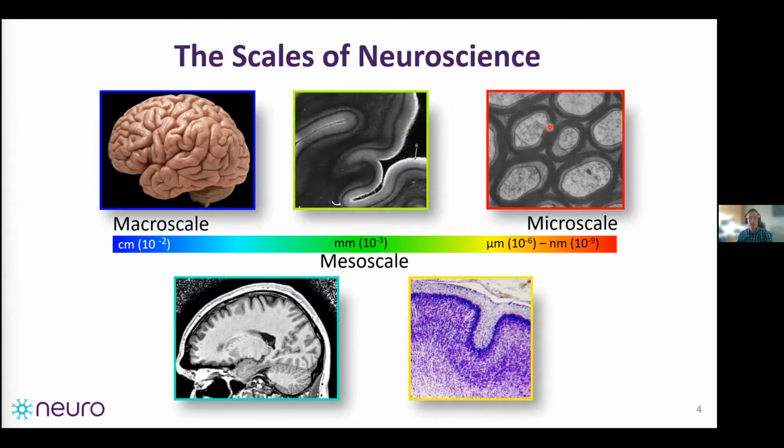So here, the best is really achieved with electron microscopy, but there's some super resolution light microscopy coming out that's giving another method to look at this, but that's sort of beyond this work. But really interesting with the microscale, we get to see the cell structures such as the lamellar wrappings of the myelin sheath around an axon. So in the span, we can see there's 7 orders of magnitude difference between the macro scale and the microscale.